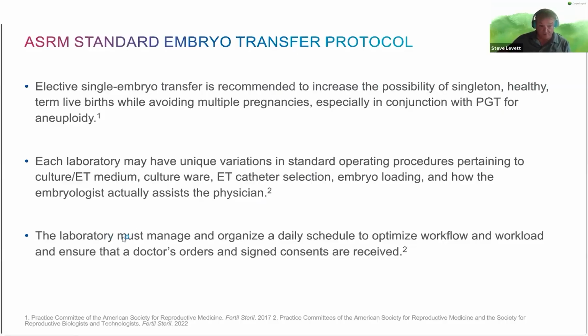The laboratory must manage and organize a daily schedule to optimize workflow and workload and ensure that a doctor's orders and signed consents are received. So again, this is important that everybody knows ahead of time what's going to happen, that the list of patients coming through is maintained, that we don't have changes, and that things are done on time, ideally, which doesn't always work out, as we all know. But these should be things that we strive for in best practice.